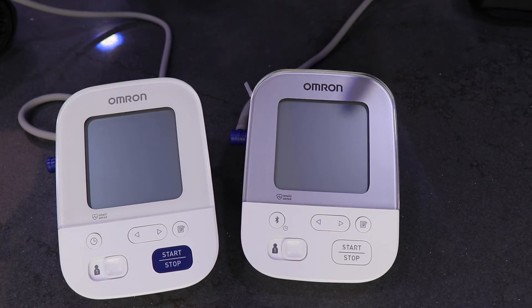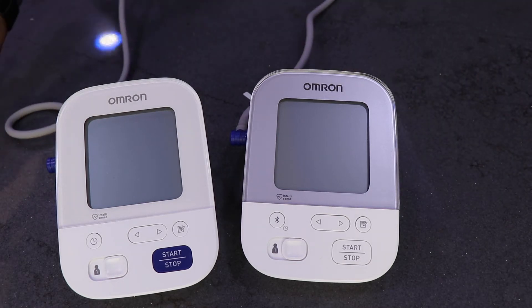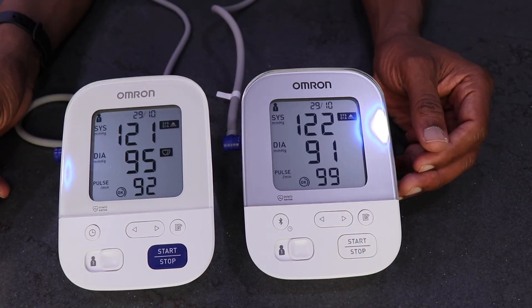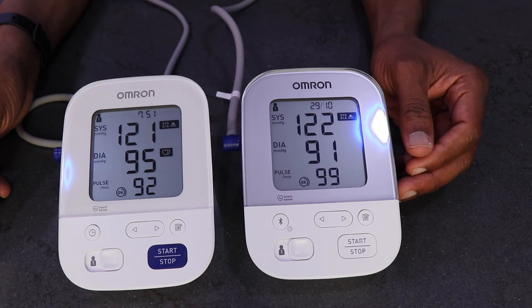We're going to put the X4 on my left arm and the X3 on my right arm and start. The right arm says 121 over 95 and the left arm says 122 over 91. The pulse is 92 for the right arm and 99 for the left arm.